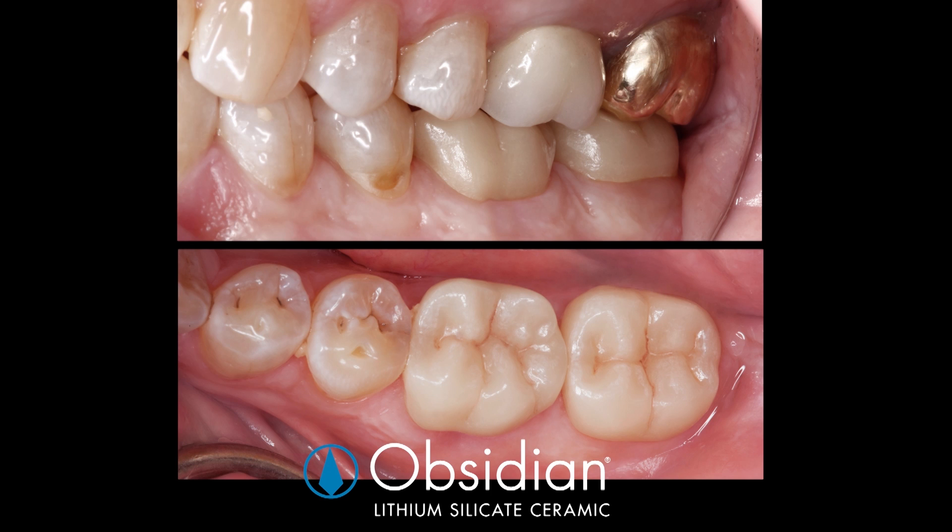We were able to deliver these restorations for this patient within a single appointment, replacing failing PFMs on 18 and 19 with very beautiful results for any type of dentistry — chairside or traditional. One of the great benefits of having a chairside system is to deliver a beautiful result within the same appointment.